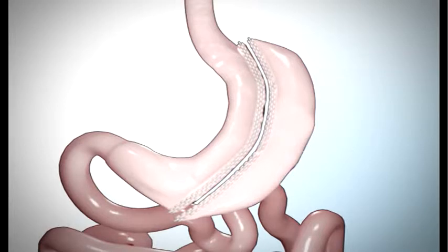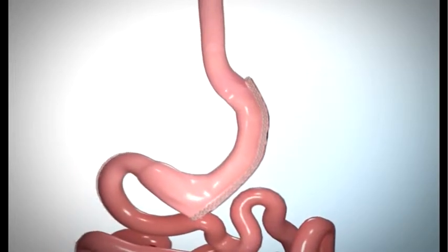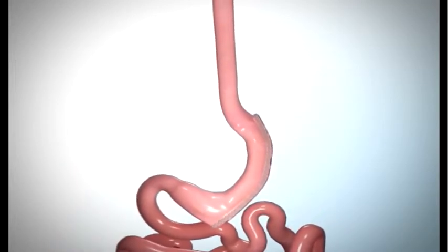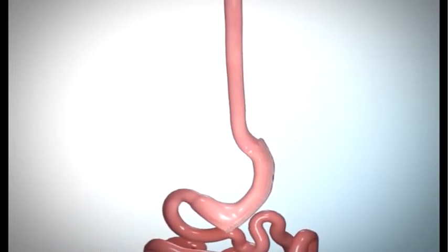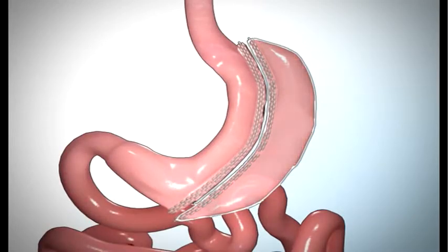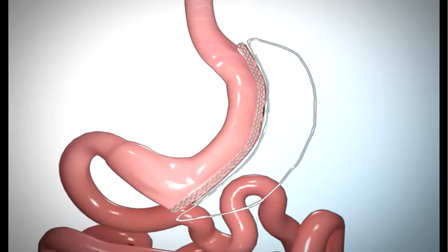The third step in the sleeve gastrectomy is removing part of the stomach. Your surgeon will remove the left part of the stomach, which includes the fundus. The fundus is one of the areas of the stomach that produces the hormone that controls your appetite.